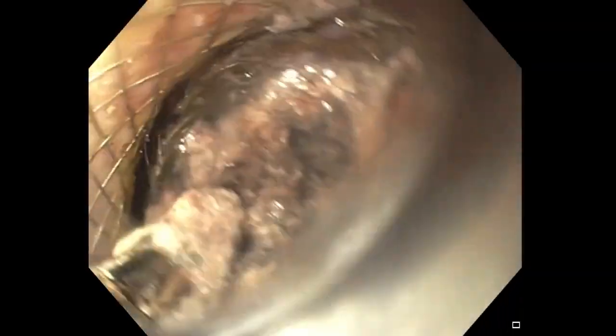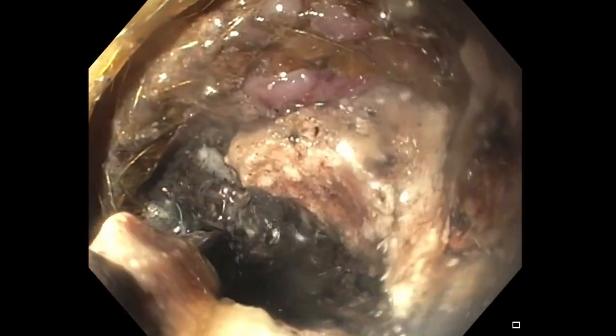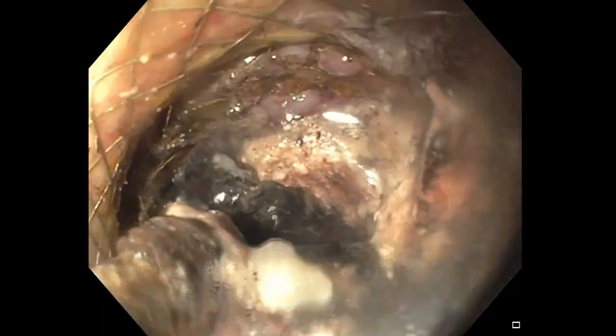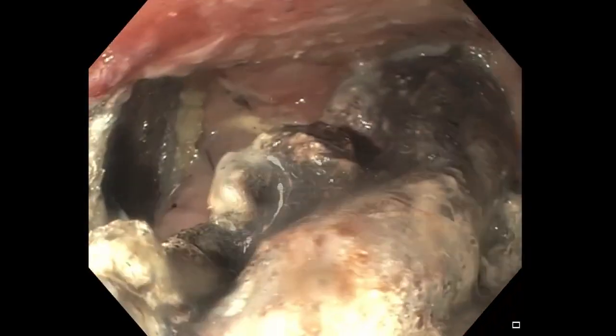This is called powered debridement, which means there is really very little effort on the part of the endoscopist. We are basically dipping the tip of the EndoRotor into the necrosis and very gently rotating the outer catheter. This rotates the window to the desired orientation.